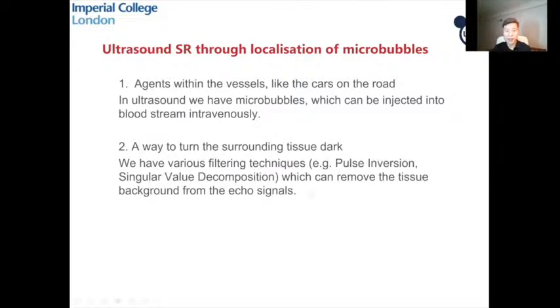We actually do have such technology: various filtering techniques, for example pulse inversion or singular value decomposition. These existing techniques can remove the tissue background from the echo signal and keep only the contrast agent, the microbubble signal.